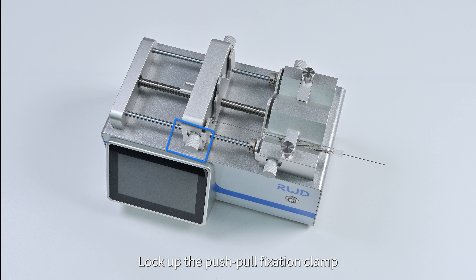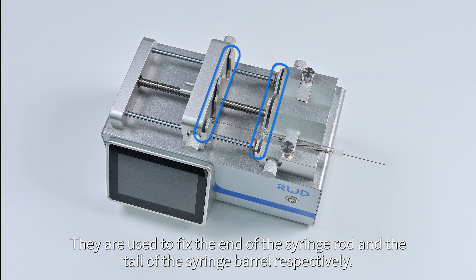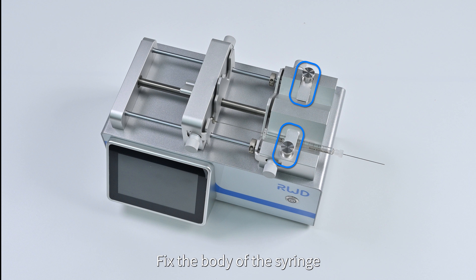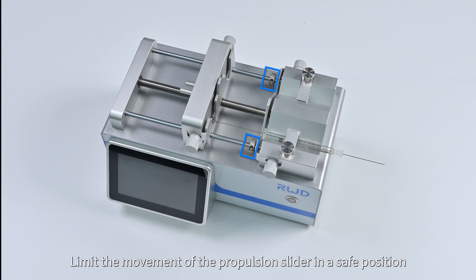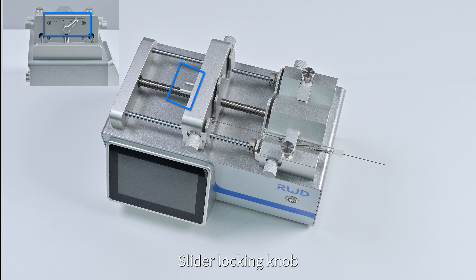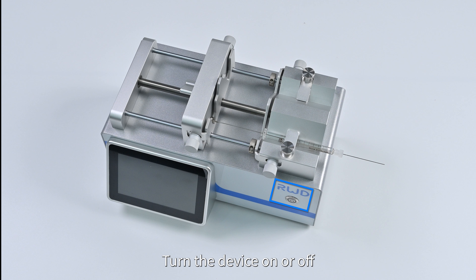Physical structure components: locking nut locks the push-pull fixation clamp; the push-pull fixation clamp fixes the end of the syringe rod and the tail of the syringe barrel respectively. V-shaped groove fixes the body of the syringe. Propulsion slider pushes and pulls the piston rod. Spacing ring limits the movement of the propulsion slider to a safe position. Slider locking knob locks or releases the propulsion slider. Display screen shows the operation interface. Power switch turns the device on or off.